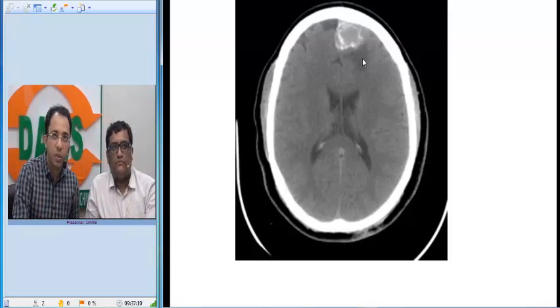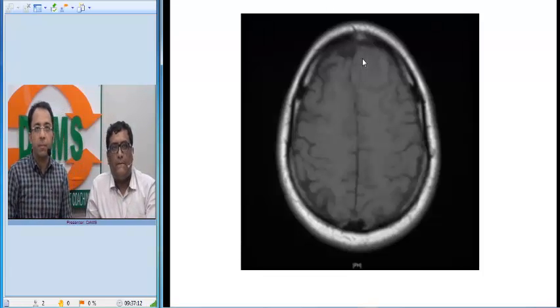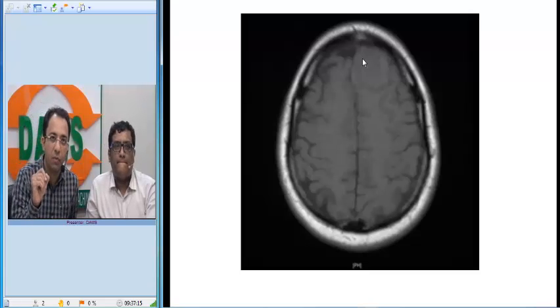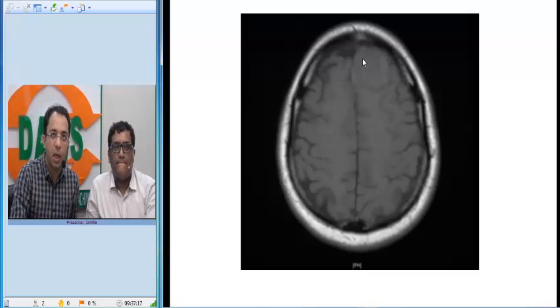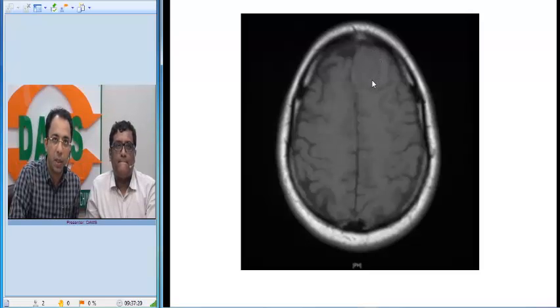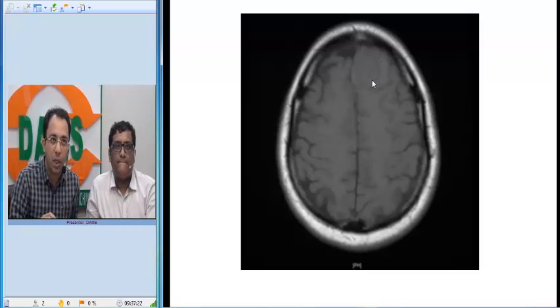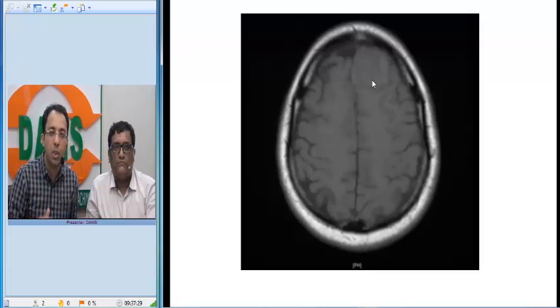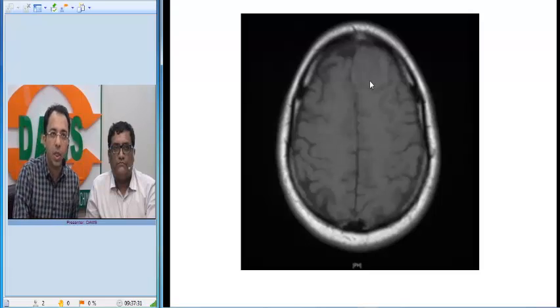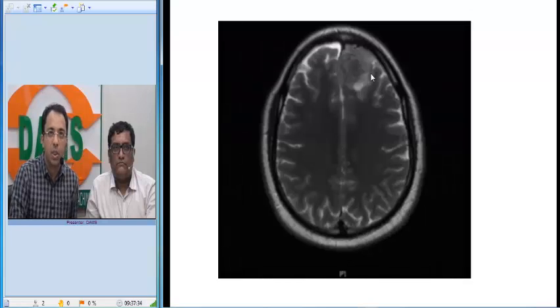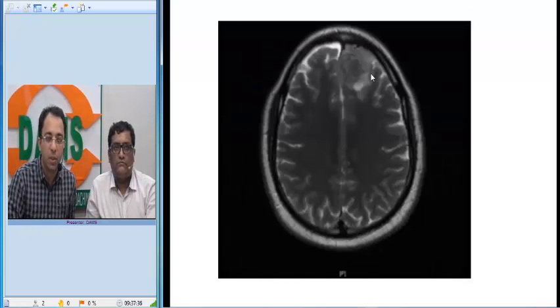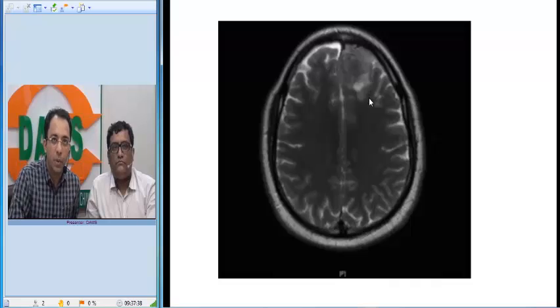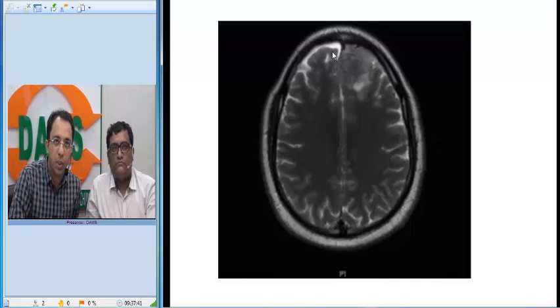MRI was advised for this patient to evaluate the lesion further. In front of you now is a T1-weighted MRI image, and you will appreciate the lesion is iso-intense to the gray matter. On the T2-weighted image of the same patient, the lesion is again iso-intense to gray matter.